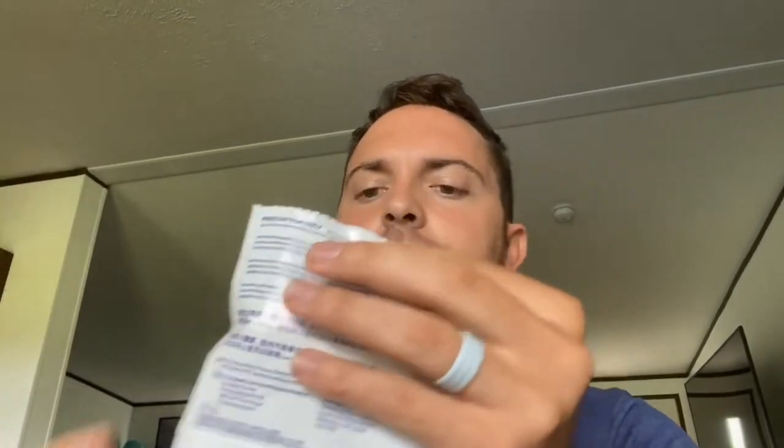Here's our first pack — it says week one, 22 hours a day, aligner number one. I'm gonna tear this open and see how it looks. Quick background on my starting teeth — what I'm most self-conscious about is this gap right here. This tooth has actually rotated away, which has created this gap. My goal with the aligners is to push them together and close that gap.